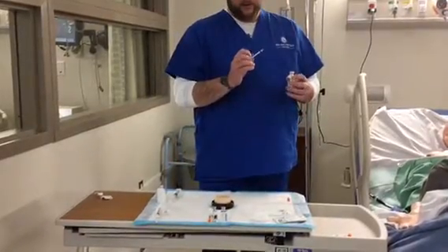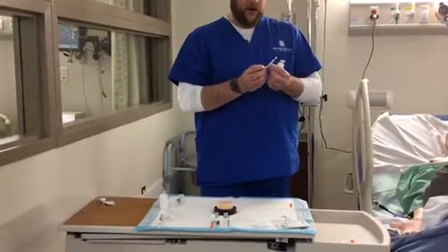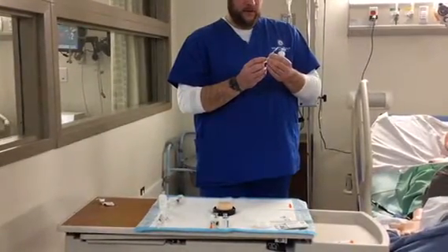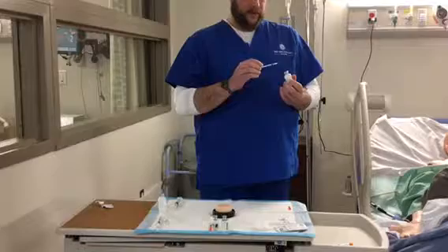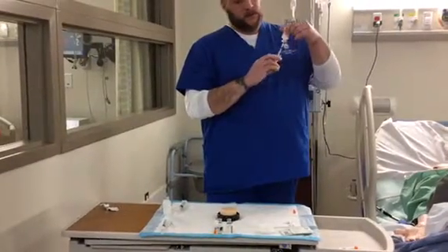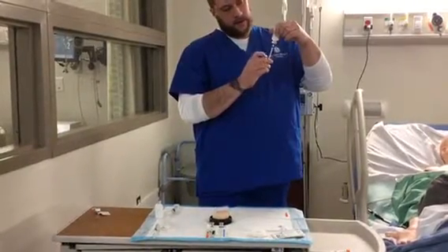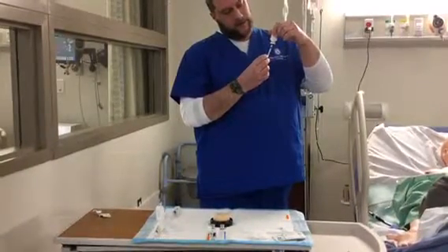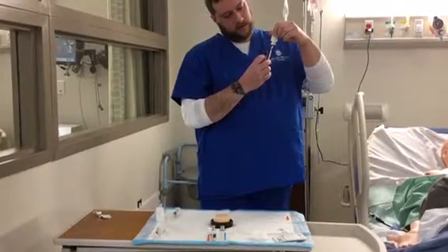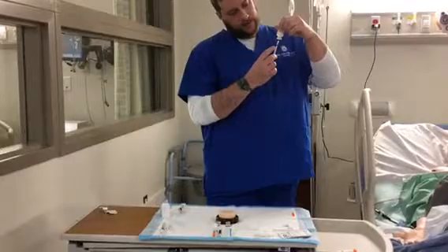For this one, say we want to do 10 units, we will withdraw 10 units of air, placing into the vial. You want to inject the 10 of air, and then withdraw 10 of the medication, making sure that there's no air bubbles.